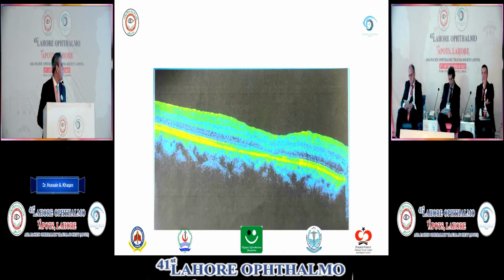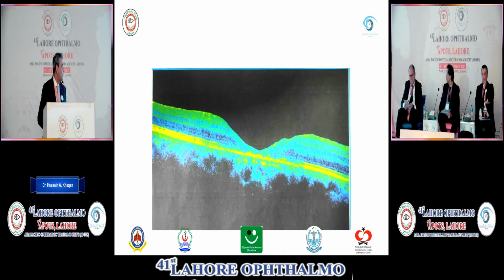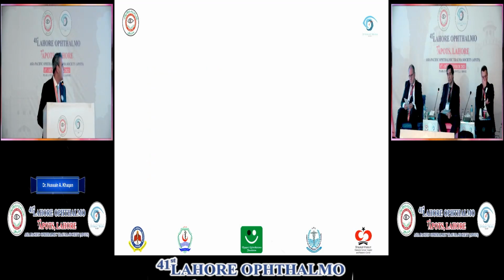This is the preoperative, and this is the postoperative OCT of this patient with macular hydrodissection and macular hole massage. Thank you so much for your kind attention. These were the few techniques that I wanted to describe: amniotic membrane graft with and without hydrodissection. If there is any question right now, if any.